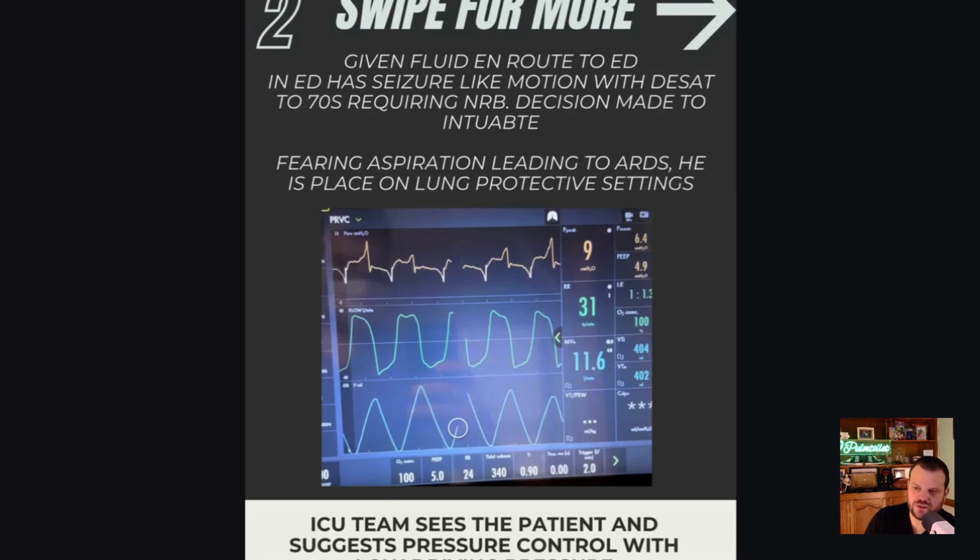And remember, on this podcast channel, at least, we try to do things that are safe. The ultimate goal of mechanical ventilation is avoid death and torture. The way that we avoid death certainly is by trying to abide by the goals of ventilation and oxygenation. Nevertheless, if I have to ventilate someone who is passive with severe metabolic acidosis, the first thing I'll do is get a time constant, because from the time constant I'll be able to figure out a rate. Once I have a rate, I'll go about 1 or 2 breaths below that just to give me a little bit of fudge factor, and then I'll figure out a volume. It's probably going to be somewhere in the 7, 8, 9 mL per kg range.